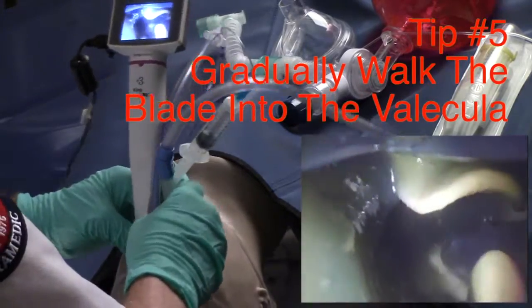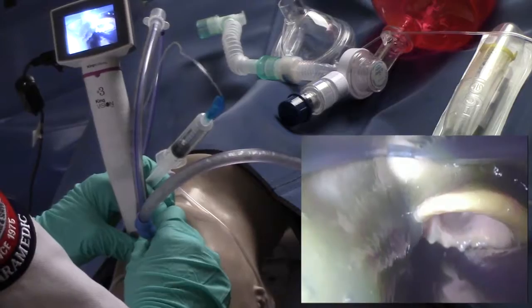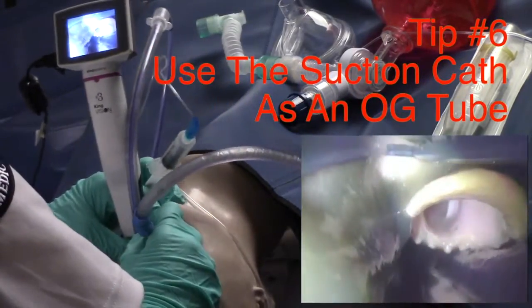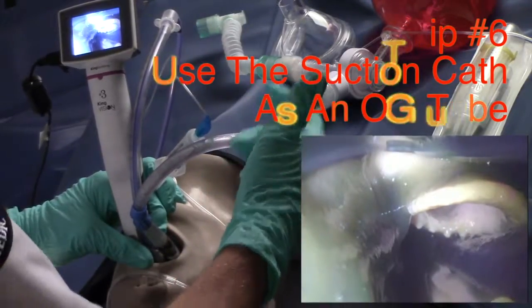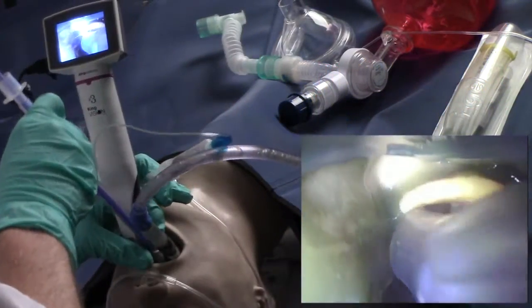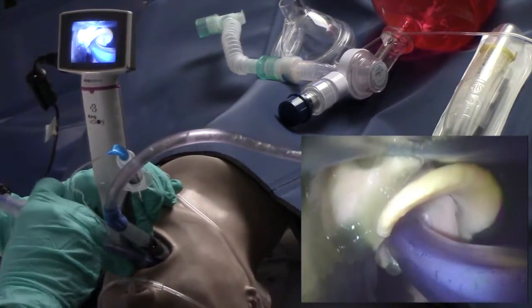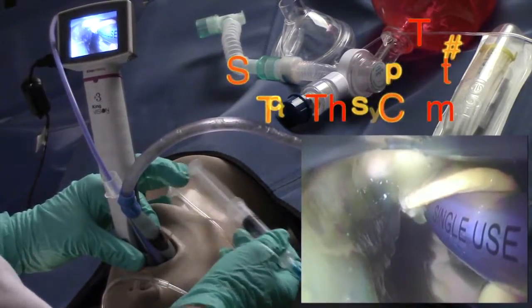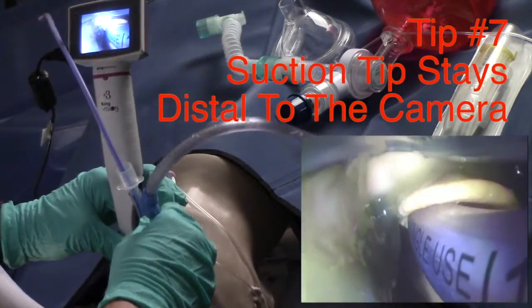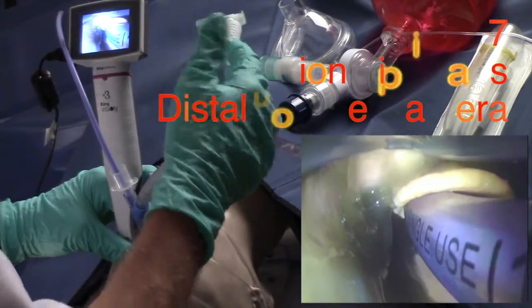And just keep going. And then just insert the suction catheter all the way down into the esophagus, so essentially you have an OG tube. And then advance your tube. So that's the key, and what you'll notice here, the suction tip is distal to the camera so that we have kept the camera out of the muck at all times.